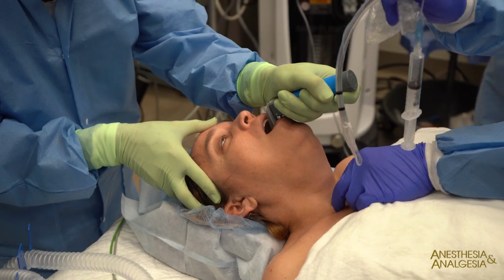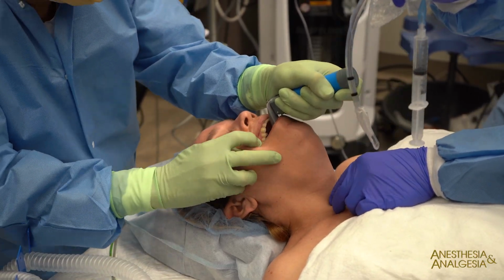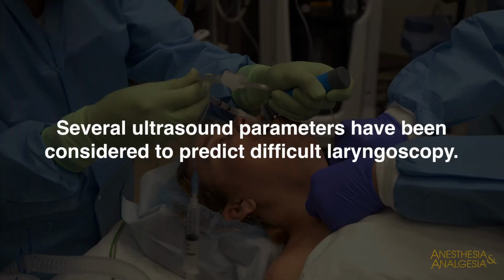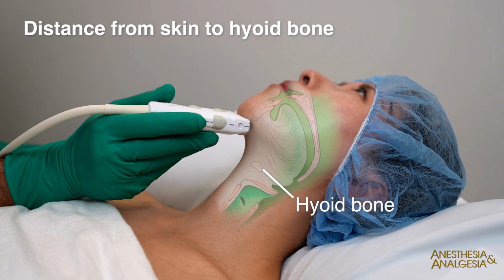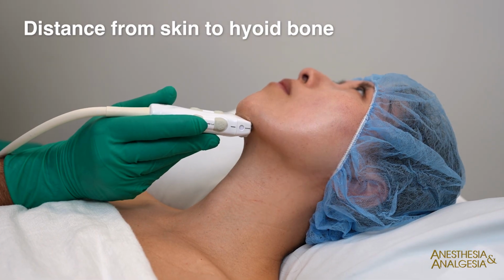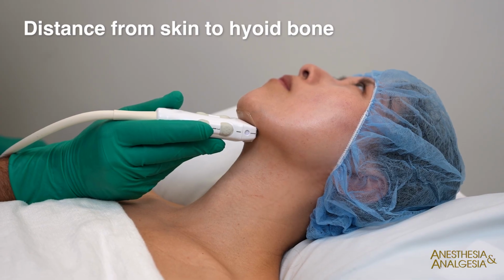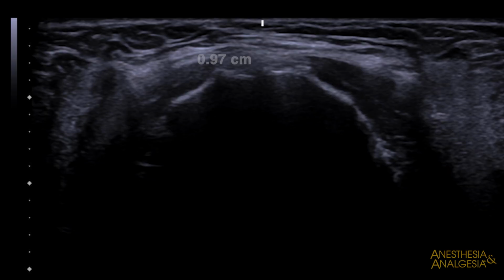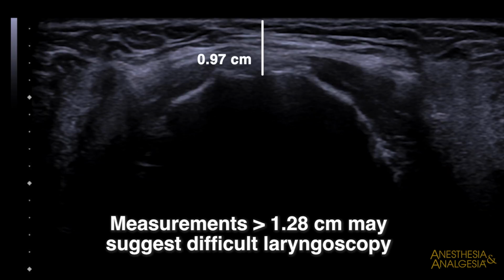Predicting a difficult laryngoscopy using POCUS is important for preventing complications and ensuring successful airway management. Several ultrasound parameters have been considered to predict difficult laryngoscopy. To evaluate the distance from the skin to the hyoid bone, place the linear probe in the transverse plane at the level of the mentum with the indicator pointing to the right side of the patient. Slide the probe caudally past the structures of the oral cavity until you visualize the hyperechoic hyoid bone. Measure the distance from the skin to the hyoid bone. A measurement of greater than 1.28 centimeters may suggest difficult laryngoscopy with a conventional laryngoscope.